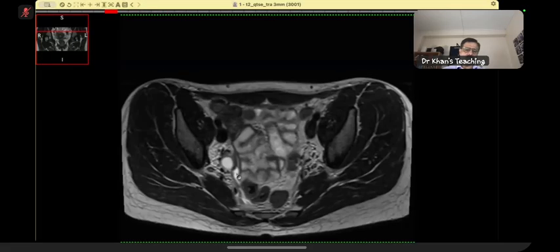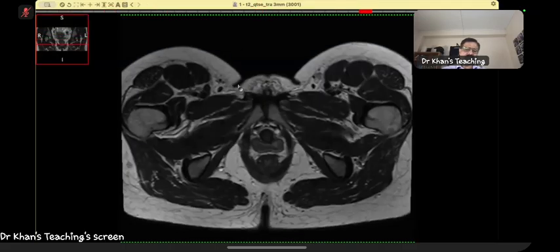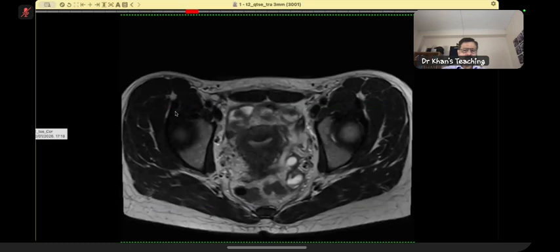So hysterosalpingogram, again, they can ask you in the exam, and they will ask you more questions on hysterosalpingogram, like technique and so on. Though the gynae people do it, they can ask you regarding the apparatus and things like that.